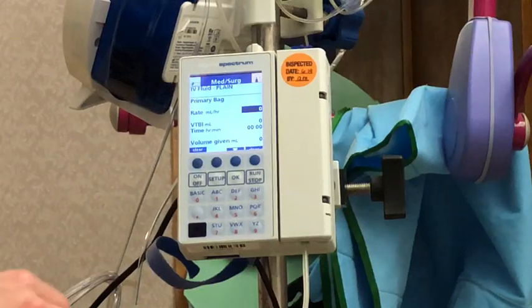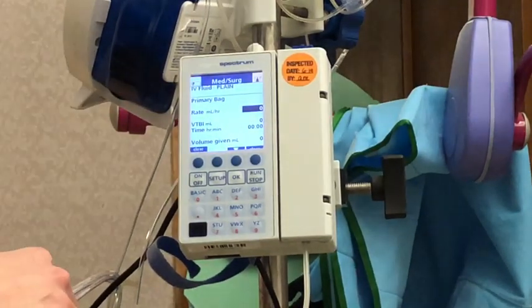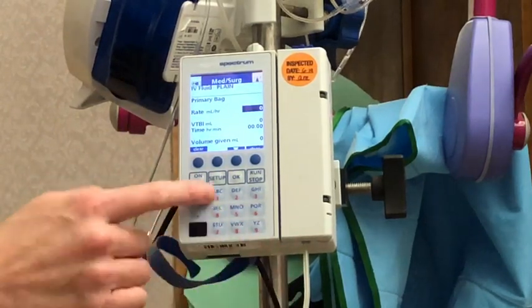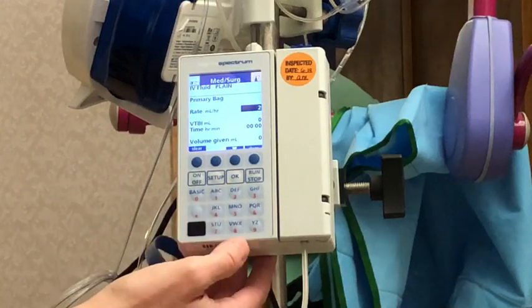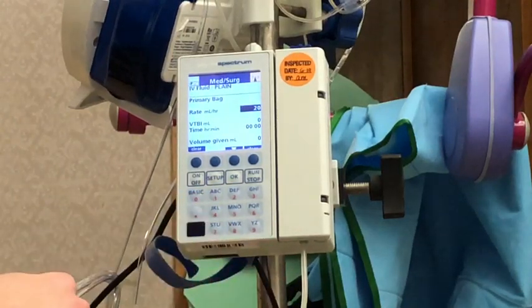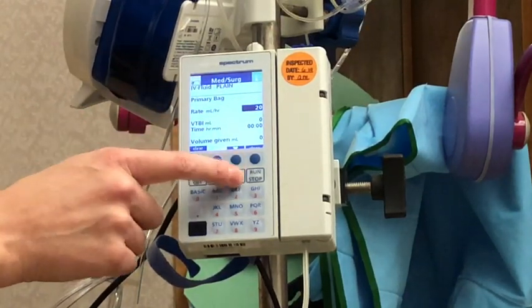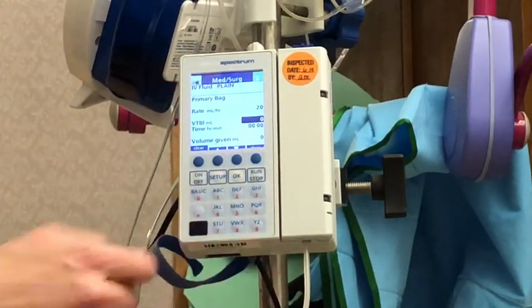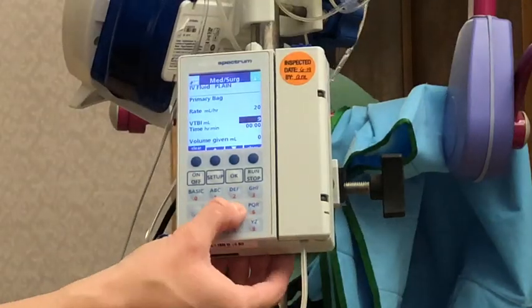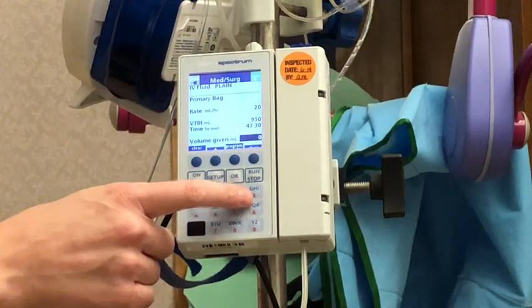You can select using the up and down arrows, then hit okay. It's going to ask you to enter the rate and volume to be infused. You can see your keypad over here with the numbers. I'm going to set a low rate of 20 cc's for right now — I'll put in 20 and hit okay. For the volume to be infused I'm going to hit 950, hit okay, and then from here I can hit run.